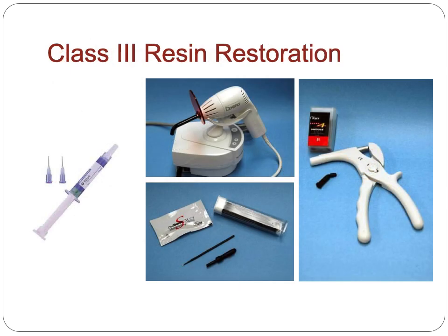Now let's speak about the restoration part. We will do that also in the lab. As you remember, when we gave the lecture of bonding technique to tooth structure, we have three steps to have a good bonding to the tooth structure. First, we need to prepare the surface, and this is done by acid etching of the tooth surface to clean the surface from smear layer and open the dentinal tubules for dentine, or removing part of hydroxyapatite on the enamel surface. So this is the first step, acid etching.